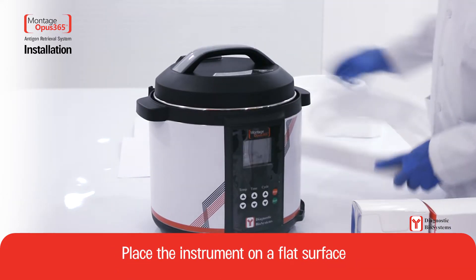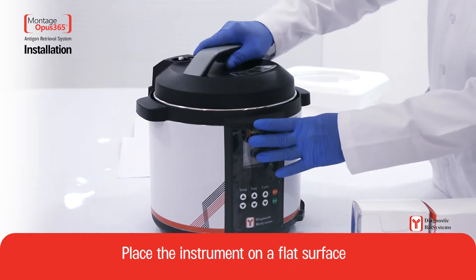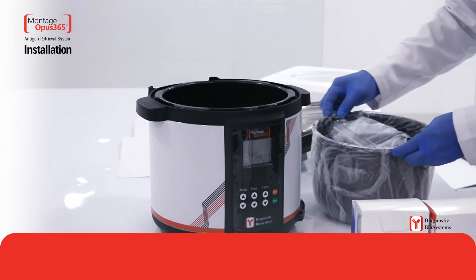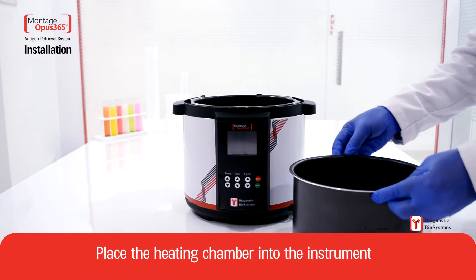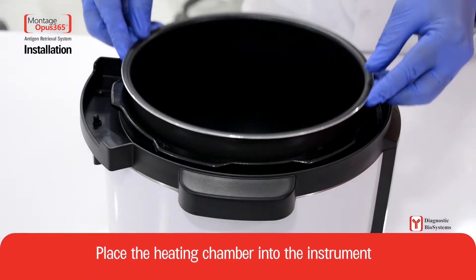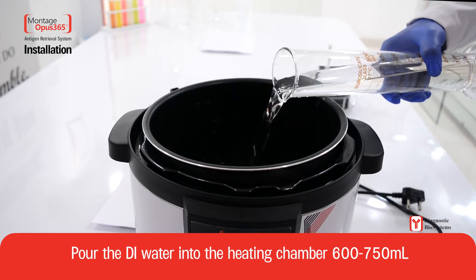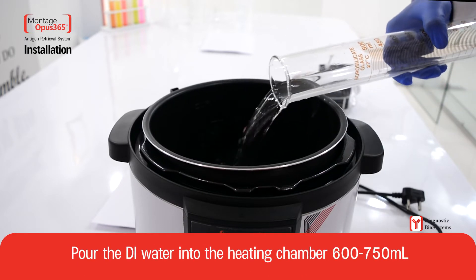Place the instrument on a flat surface. Place the heating chamber into the instrument. Pour distilled water into the heating chamber, 600 to 750 milliliters.